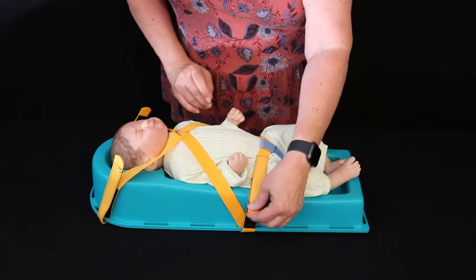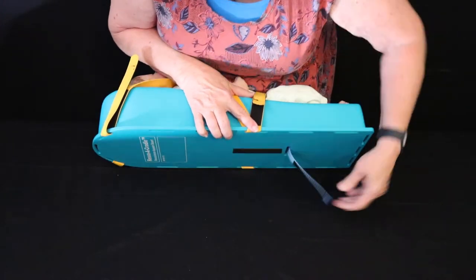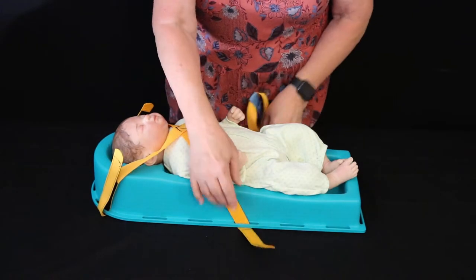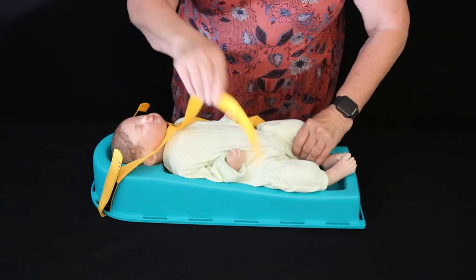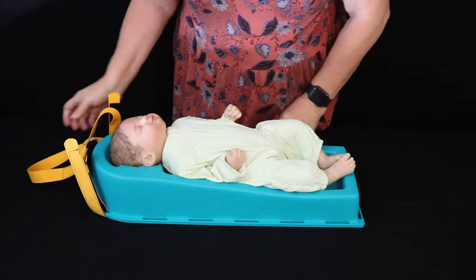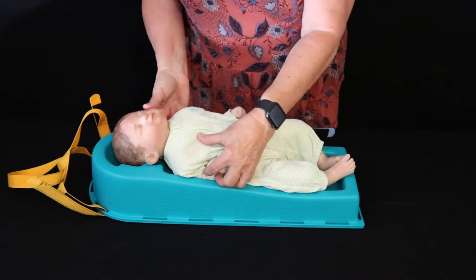When you're in the process of removing the baby, once you get to the hospital, you simply remove the crotch strap, undo the hip strap, loosen the side that's on the left side of the baby, and you can remove the baby quite easily.